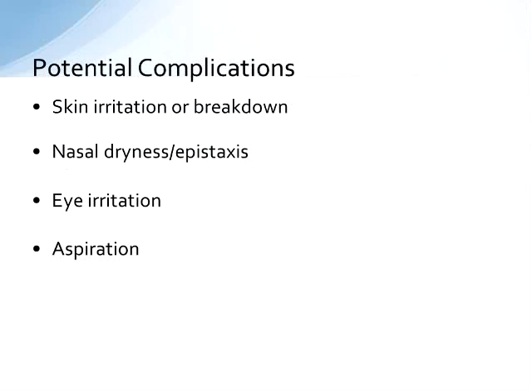So, potential complications associated with non-invasive ventilation. This is not limited to pediatric patients, but it's true of most non-invasive ventilation. Our kiddos are at risk for skin irritation, breakdown up to pretty significant breakdown, nasal dryness, maybe a bloody nose, and eye irritation if there's a big leak up near the bridge of the nose blowing in the eyes.